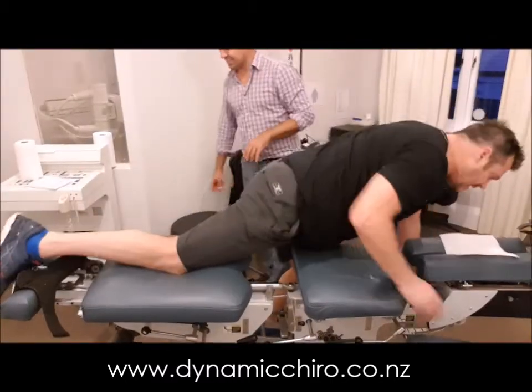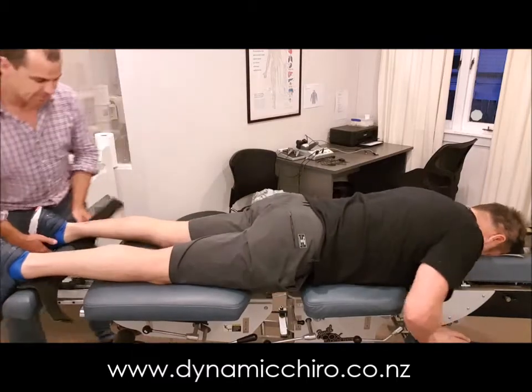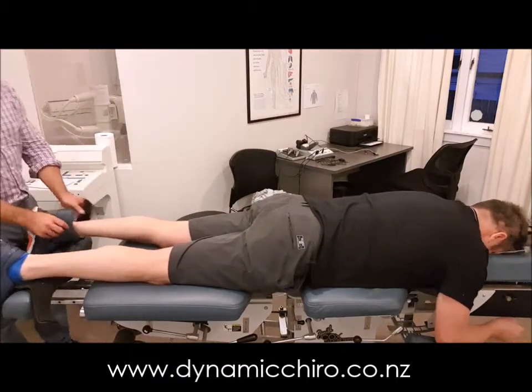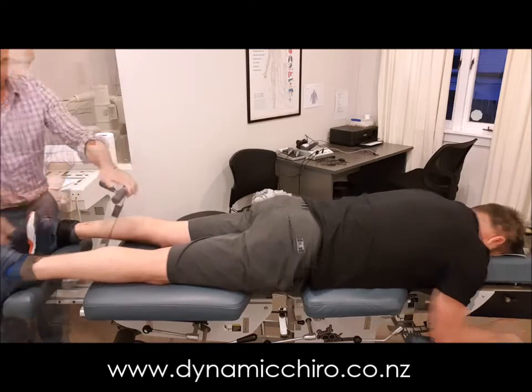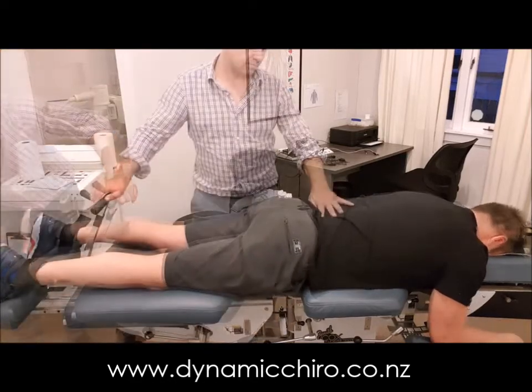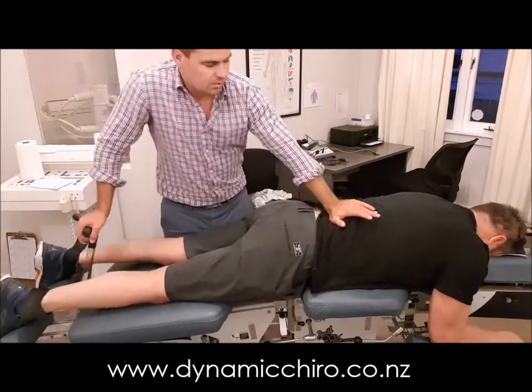The first thing we're going to be doing is loading the client up onto the table. That's really important because they're quite often in a lot of discomfort. The fact that he could climb on himself was actually a real benefit in this instance. So next we're cupping the ankles — we're going to make sure we can brace them and then we're going to be stretching out that lower back.